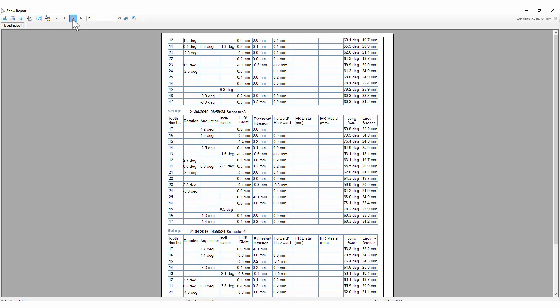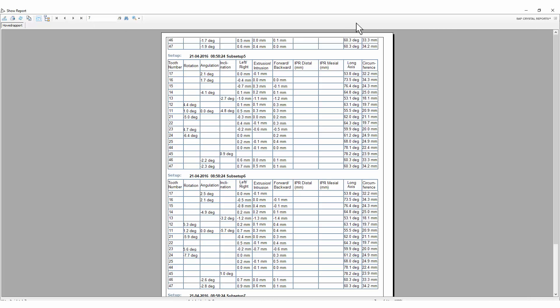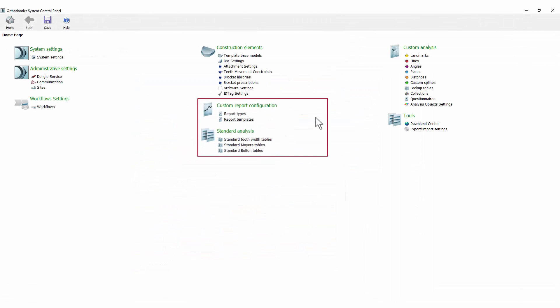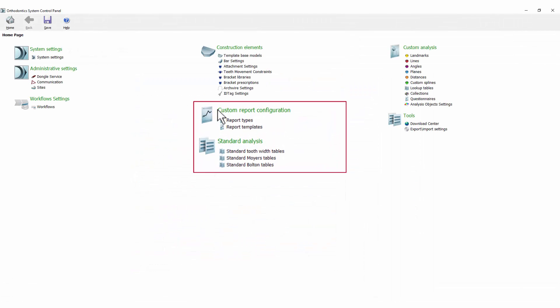Now we will go to the AuthorControlPanel and show you how to set up the reports. When in the AuthorControlPanel, go to the Custom Report Configuration section and select Report Types.